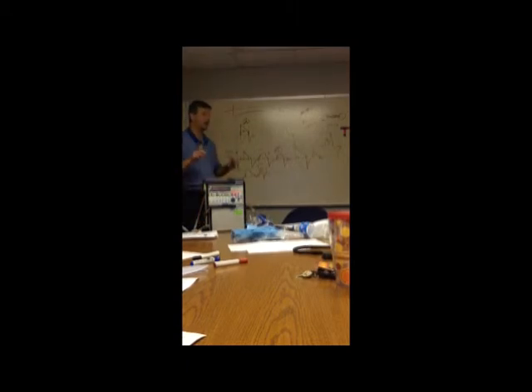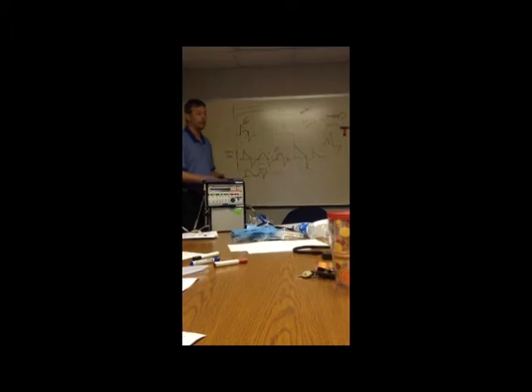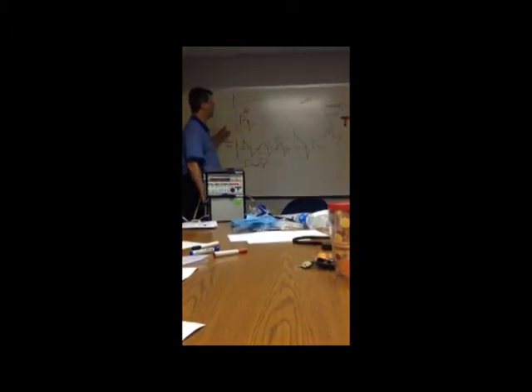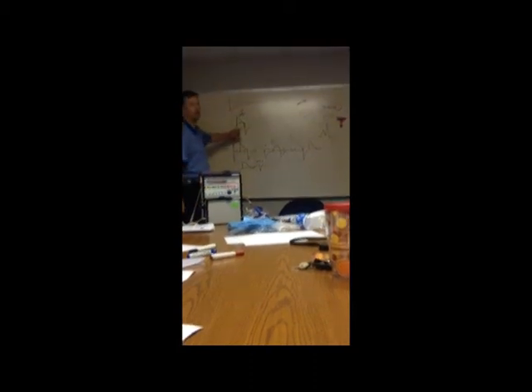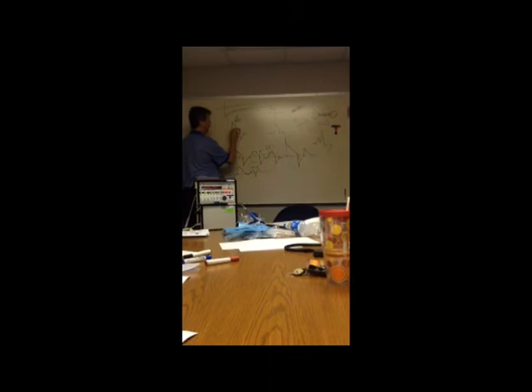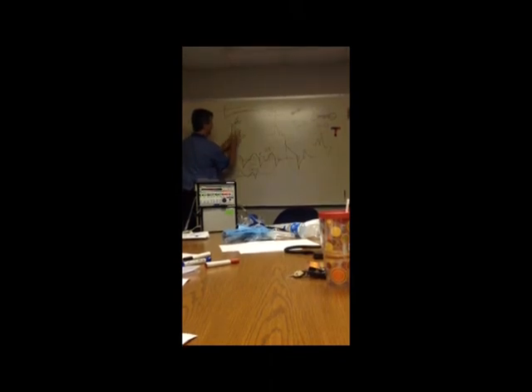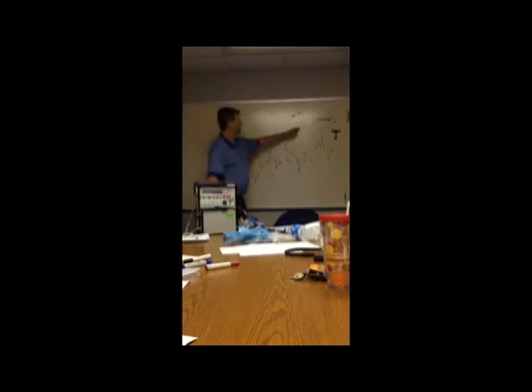All right, so what I'm going to show you now is the difference in the pressure and volume breaths, and that'll make up the 5. You've learned 3 different breath patterns. The other 2, which aren't technically modes, but we consider them modes, is when you add a different breath type to the modes I've talked about, okay? So this is a volume breath. That's all we've talked about. It delivers a set volume at a certain amount of time. When that volume has been delivered in that amount of time, it lets them exhale and does it again.